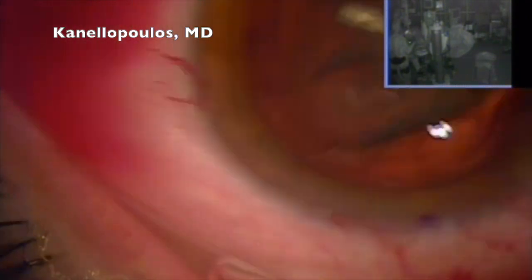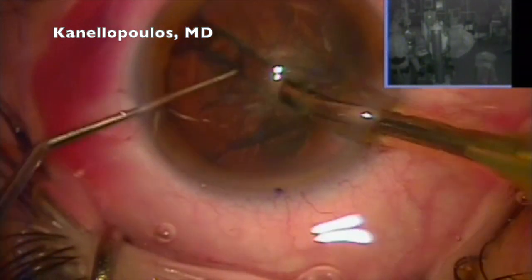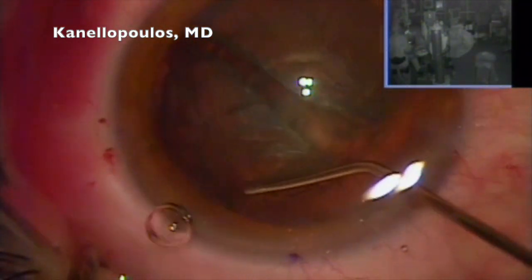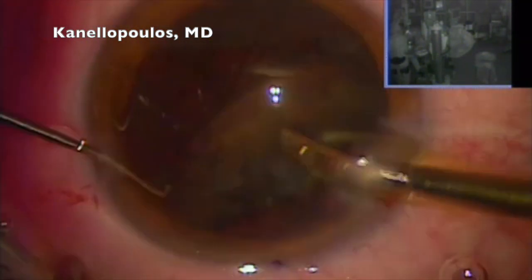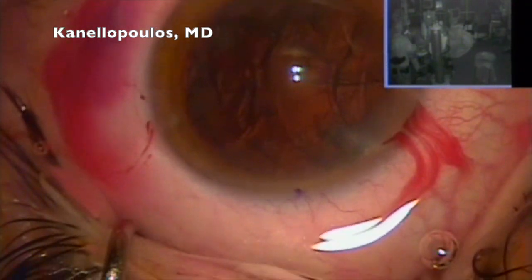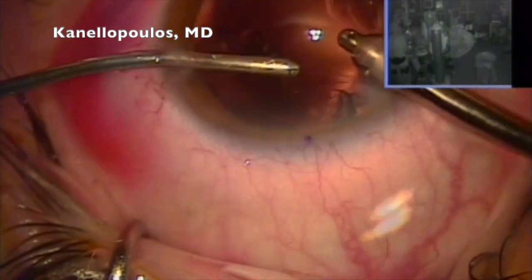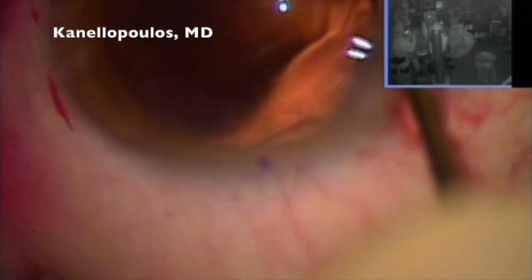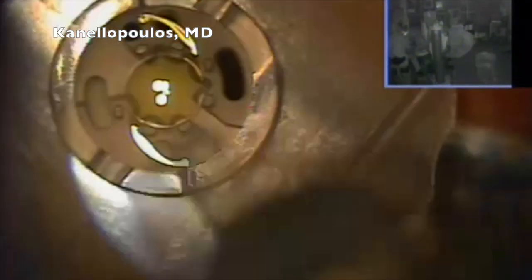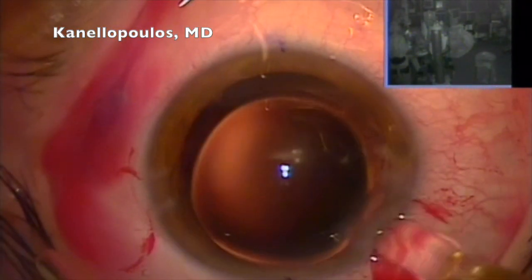Continuous curvilinear capsulorexis completed, hydrodissection. We're going in with a Signature FACO tip to work on divide and conquer. I'm seeing that the lens is quite soft, so I'm expressing the lens, putting visco underneath, expressing the lens into the anterior chamber, removing the lens again — my split with my left hand under the main incision — and filling with viscoelastic methylcellulose, polishing the posterior capsule.